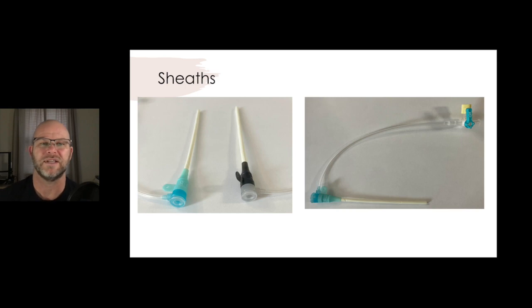So what's the process of having a heart cath? Well, first off, you have to break into the body. Remember, in this video we're primarily going to talk about left heart caths. You need a sheath. So what's a sheath? All it is, is an IV catheter, except where fluids would normally hook up, this has a gasket there, and you can pass wires and balloons and stents and catheters through that.